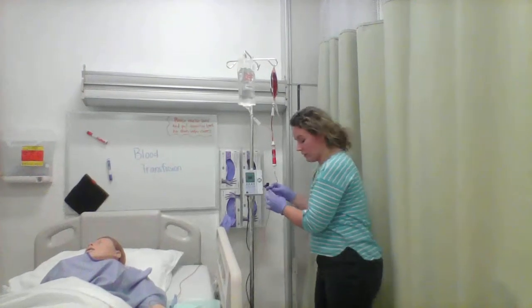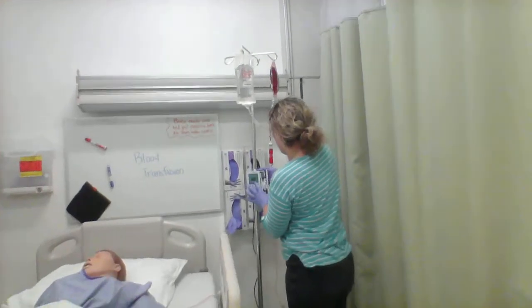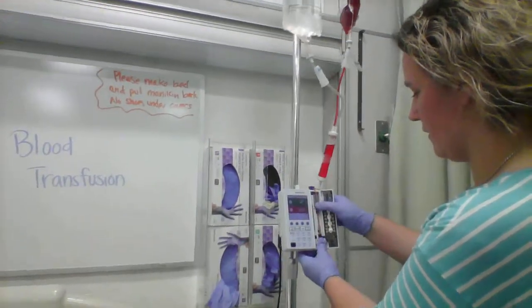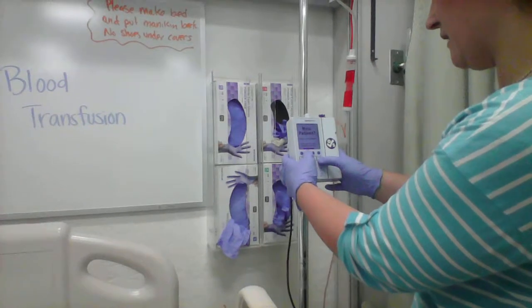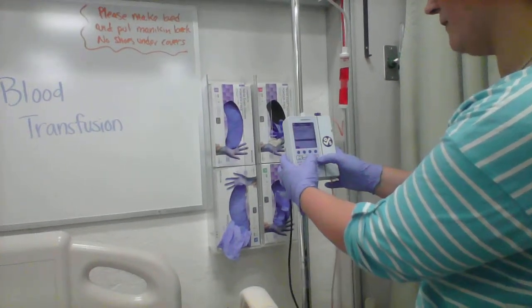And now we're going to go ahead and set the pump. We're going to put our tubing in. We're going to say this is the clearing program. This is an adult.